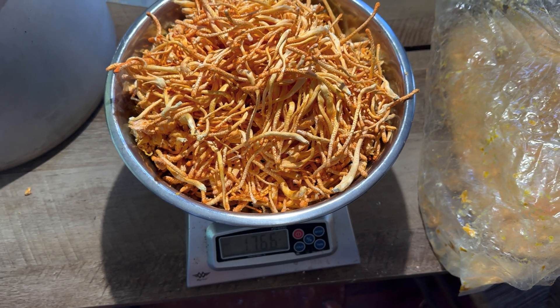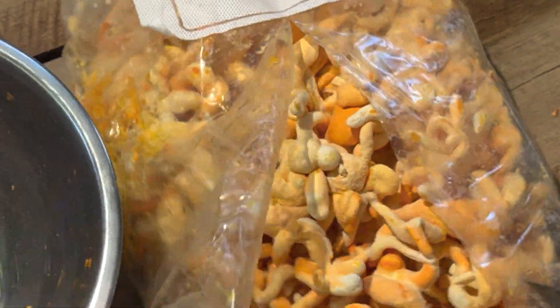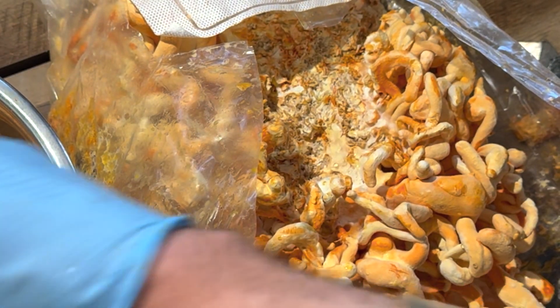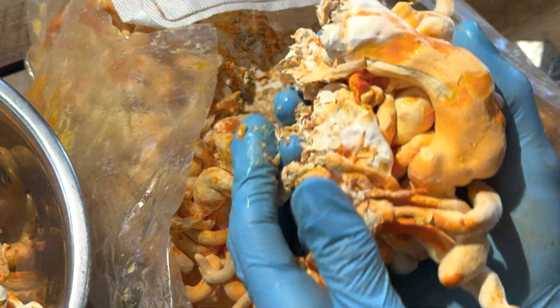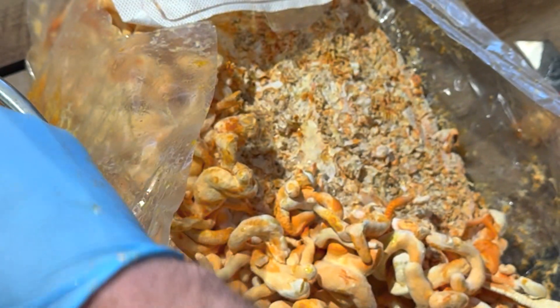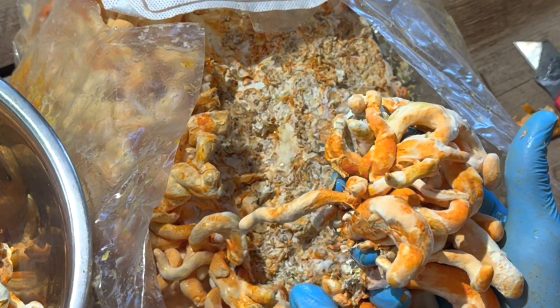We are currently testing a more blended trifecta. This is a new strain cross we got from Appalachian Gold and it is insane how big they are and how sticky they were. I'm still trying to figure out if I can see the nodules on there — it's so weird.